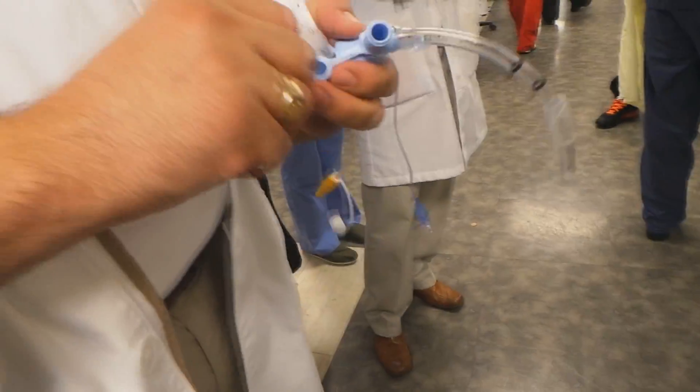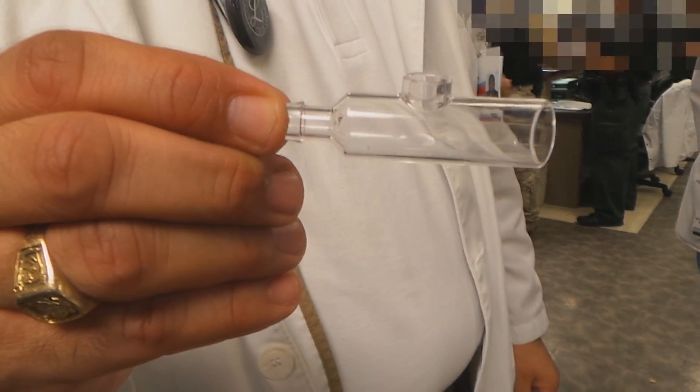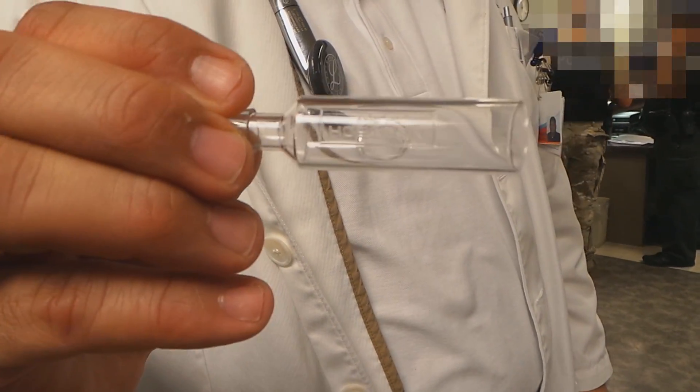You also need something that you don't see anymore, which is a meconium aspirator adapter — you can get that from the NICU. We're going to get two to have set up ahead of time, in Neotech. Meconium aspirator adapter.